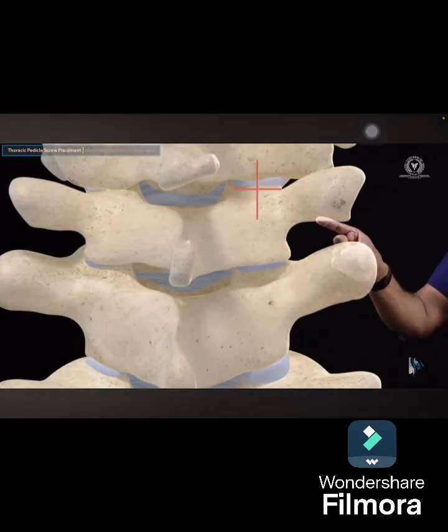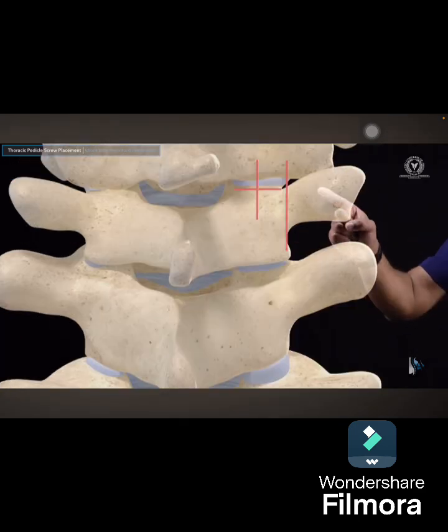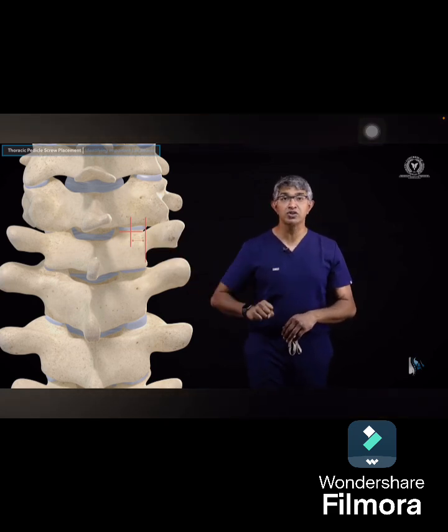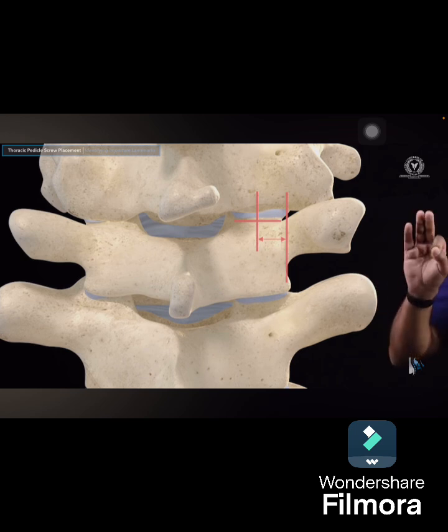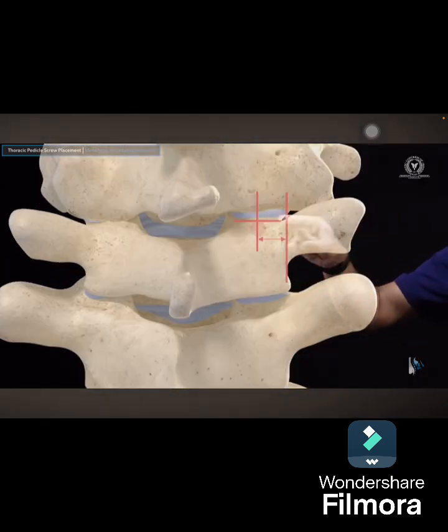So the width of the pars is another important landmark. And if you look at this line and extrapolate it all the way up here, it gives you a sense of width. Now, one interesting thing about the thoracic pedicle screws is that this is the range that you have available to you when you're putting a pedicle screw in. So now if you imagine you can put a pedicle screw all the way here, kind of splitting. So again, where is that? That's at the midpoint of the joint.